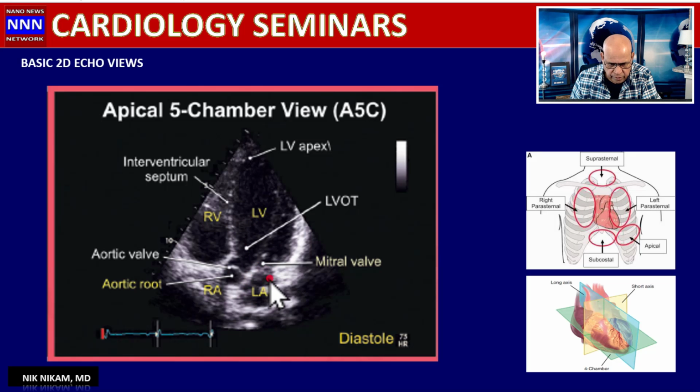They're sort of foreshortened, but now we get a very clear picture of the aorta, the outflow tract, and the aortic leaflets. This is a great view because this is parallel to the transducer. We can get excellent recording of the aortic valve gradient, and we can also look for aortic regurgitation. Then we look for wall motion abnormalities. We can also measure the left ventricular outflow tract for calculating the aortic valve area. And of course, here is the mitral leaflet.